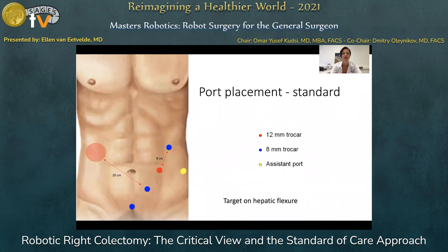Port placement is from the suprapubic area to the left hypochondrium with a target on the hepatic flexure. We need to keep in mind that we keep our distance from the target zone and we place the camera in port number two and the stapler trocar in port number three.